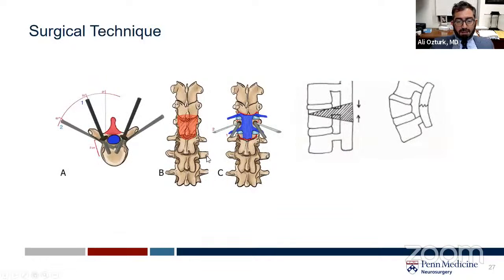These are a few diagrams also demonstrating the extent of the bony resection. As I mentioned, once the posterior elements are removed, we ideally want to be looking at the dura of the spinal cord and 4 exiting nerve roots with a good portion of the nerve roots visualized. These 2 nerves, obviously on either side, will now be sharing one large shared foramen.